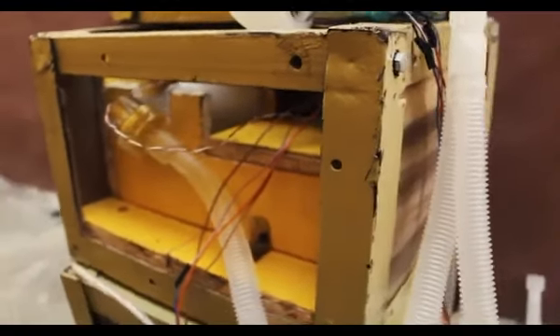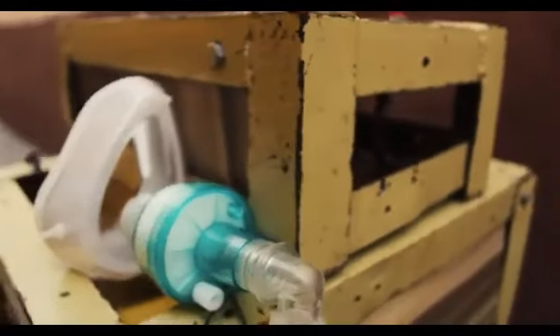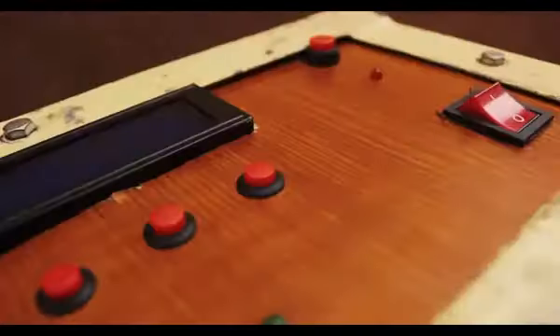Vent 1.0 has 3 compartments, which are the power compartment, the mechanism compartment, and the control compartment. The power compartment basically carries the battery and the battery charger inside of it, while the mechanism compartment houses the mechanism, which produces a linear function to compress the Ambu bag, and also houses the Ambu bag, while the control compartment carries the ICs and all other functions that are used to control the movements of the mechanism.